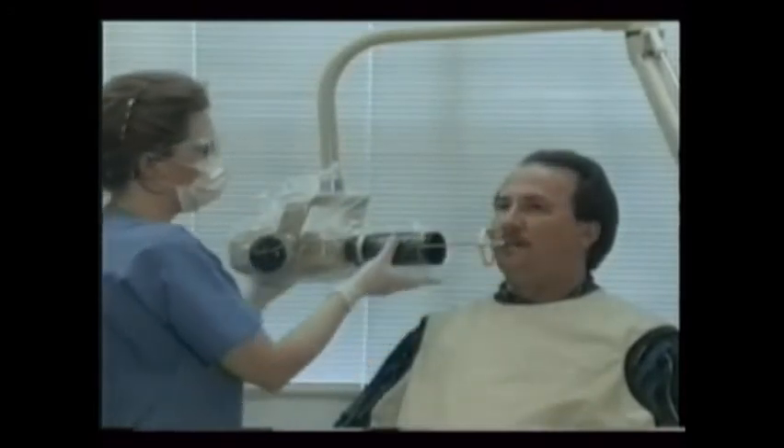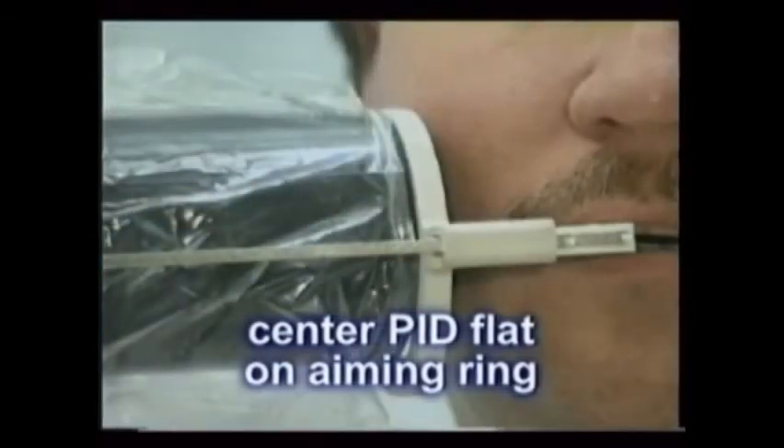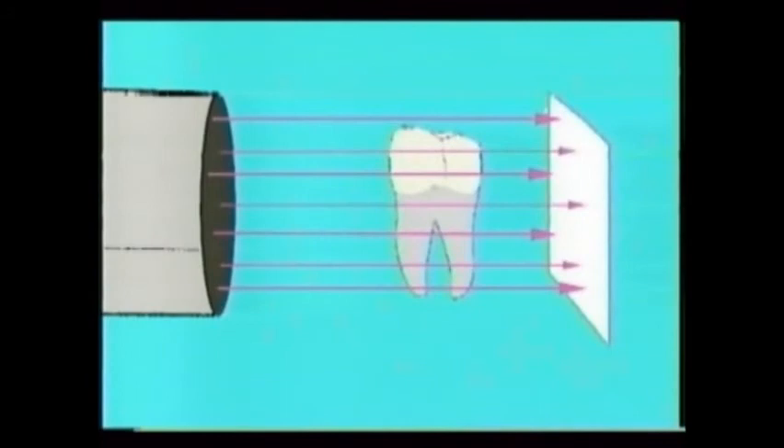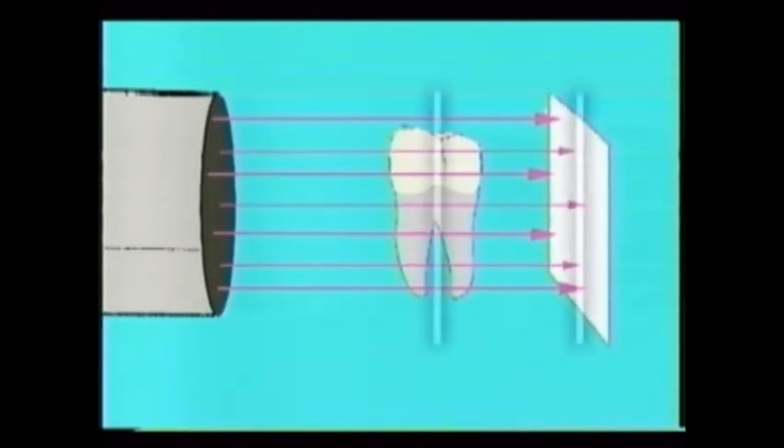By properly placing the film as described and centering the x-ray tube head flat on the aiming ring, it will be hard to miss the x-ray. Two x-ray techniques may be used. The first is called paralleling, which means that we keep the teeth and the film as parallel as possible and let the x-ray beam hit both at a right angle.